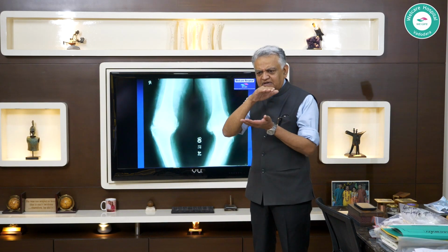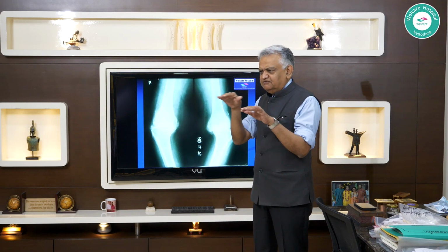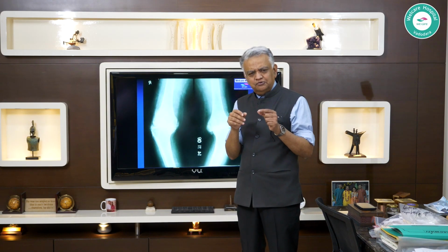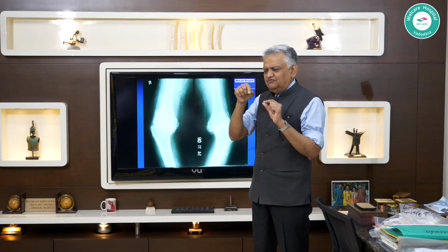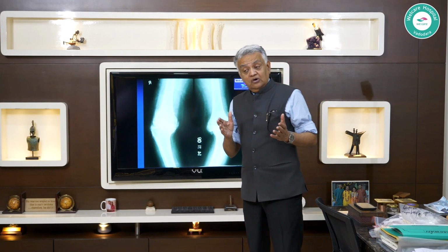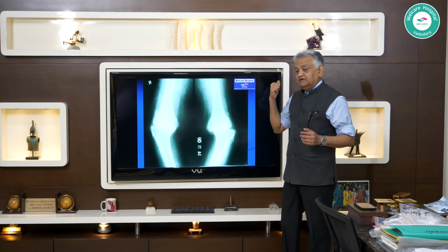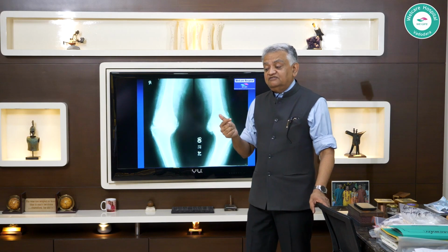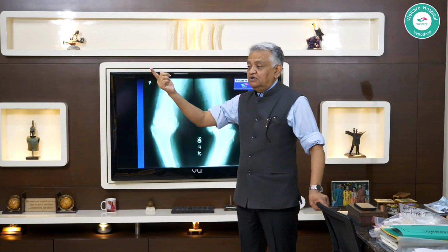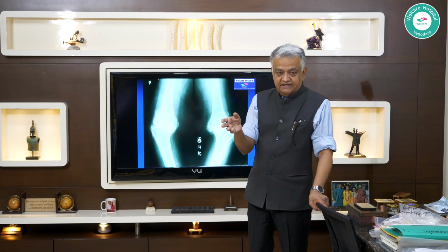One is, will my tibial cut equalize it to the point where now all I have to do is put a bit of maybe 1 or 2 K wires or screw heads and cement, or will it be so much that I better adopt an implant system which allows me to migrate to a highly constrained or fully constrained femoral and tibial combination, which means a TC3 type.